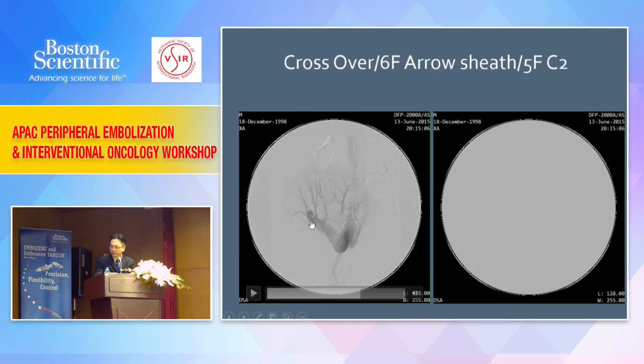Maybe a bit back, then slow down. Now what are you going to use to embolize? See if you can identify all the feeders and then go very selectively and coil. Yes, I fully agree with you. In this situation, point source coiling at the site of the fistula is the primary aim of treatment.